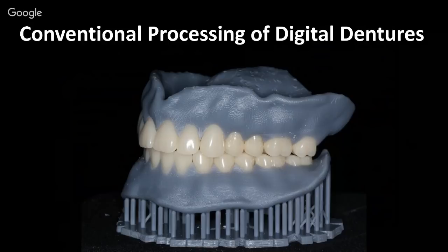Another question that came in: can we print a flipper? Okay, so can you? Yes. Should you? I probably wouldn't recommend it. When I think of a flipper, I think of the missing lateral incisor, where it's going to have this tiny little thin piece of acrylic supporting a tooth that's just kind of standing out there in no man's land. I think that would be very prone to breaking. But could you generate the file?